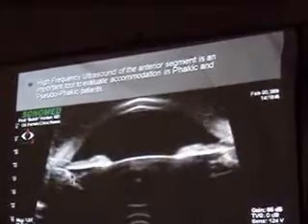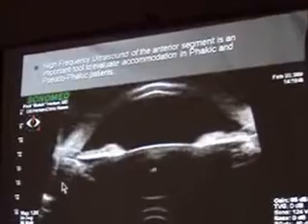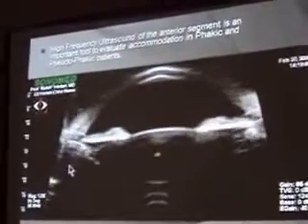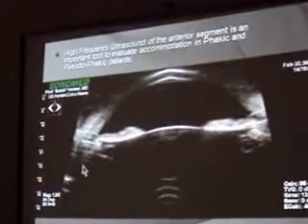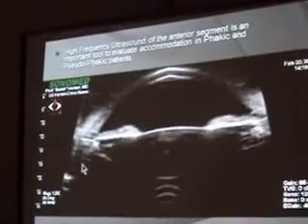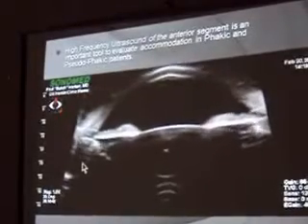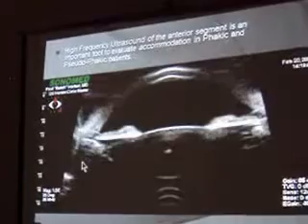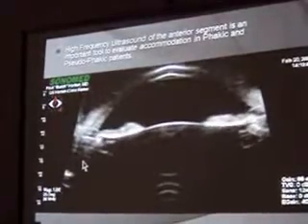The second area to see is the ciliary body and how it is moving. The ciliary body is moving inward and forward. Many people have been thinking, and probably many of you, as we have been doing, that the ciliary body was contracting inward only. It's not inward only, it's inward and forward.